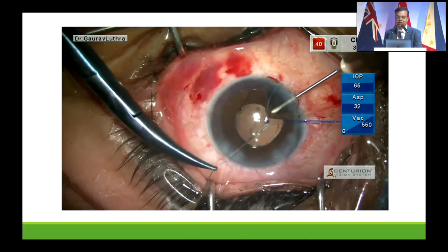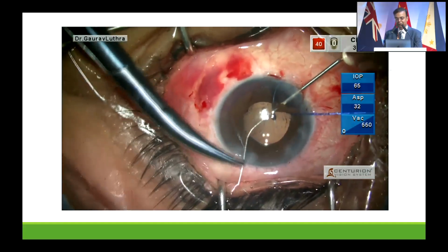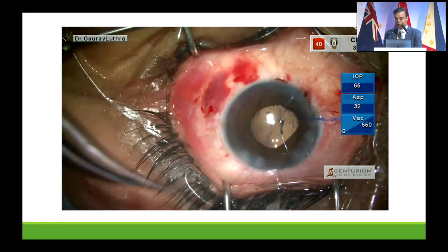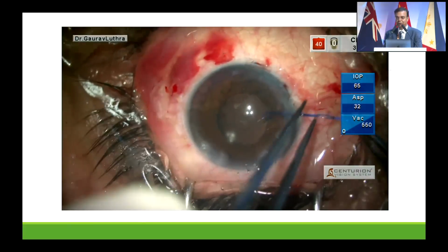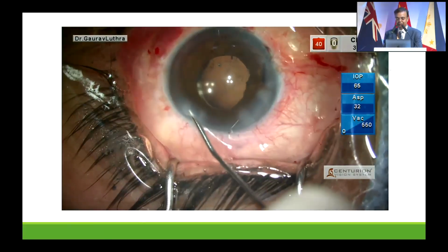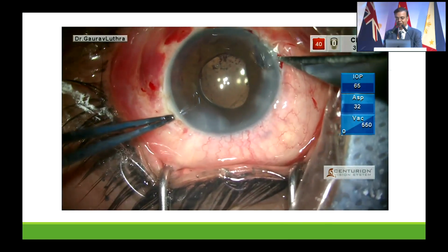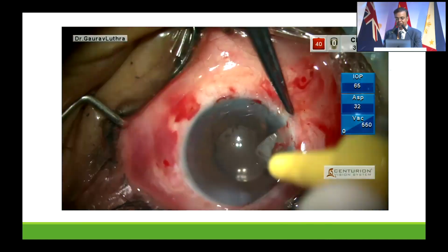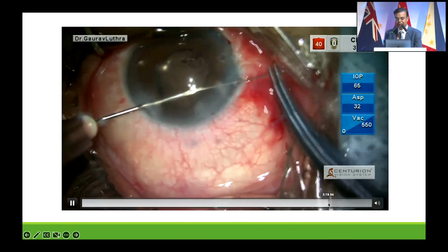Today I see almost everybody uses this technique, and when I did this about 5-6 years back or maybe longer, this was something new for me, and it was learnt during this case, and of course after that I've been using this way of passing all my sutures for iris. And I mean most surgeons will reach the same place eventually. They'll improvise and find the correct solution. So this is the third suture. So eventually we had a good repair done.